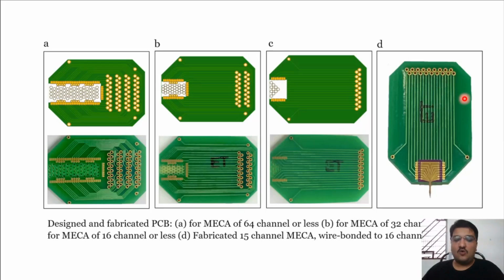Now further, how will the entire microelectrode assembly look, or what are the rest of the things required to finish the loop? What the microelectrode does is record the biopotential from a deeper region of the brain. What the PCB does is act as a signal conditioning circuit. But after that, how are you going to transmit your biopotential from your PCB to the real world, for finally any kind of conclusion where you are going to see all this? That is basically the entire system based on microneedle microelectrodes. So I'll quickly show you the system, or microneedle assembly.